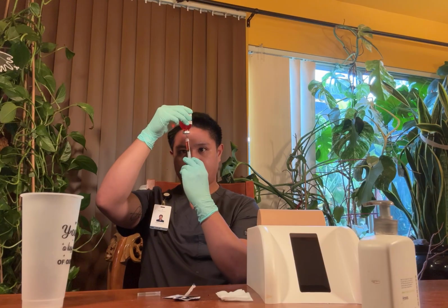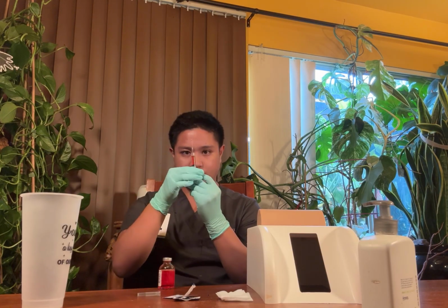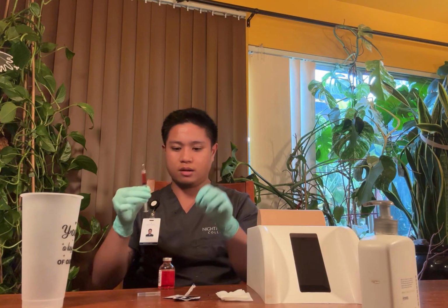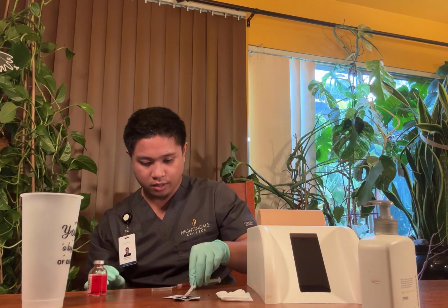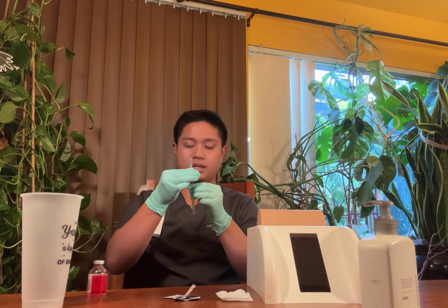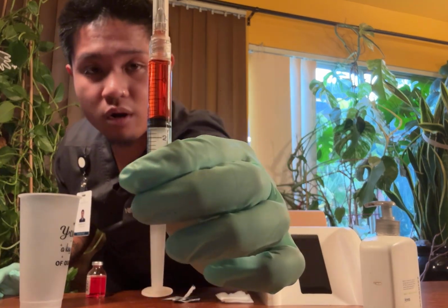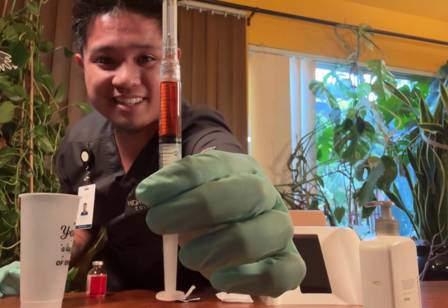Just in case, I'm going to make sure that all the air bubbles are out. Okay, and doing the one-hand scoop, I'm going to scoop the needle into the cap and close this, and then show you for a few seconds that I've drawn 1.5 milliliters of morphine.